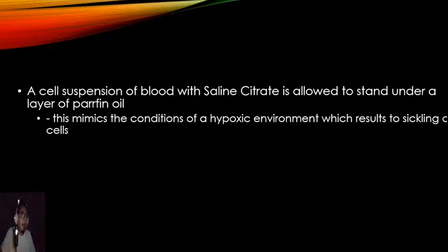And I've only done this once as a test experiment when we received a reagent lot of the kit for sickling test, and we didn't like it. We actually performed better with the solubility test. But it was a fun way to test for sickle cells.